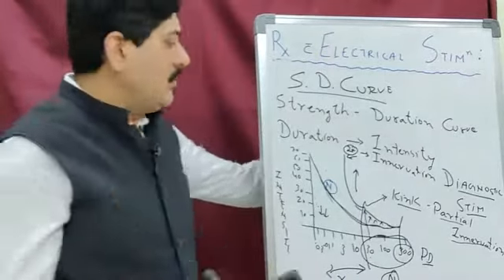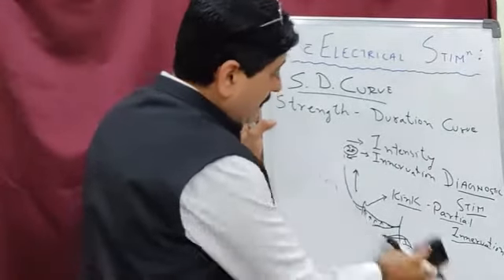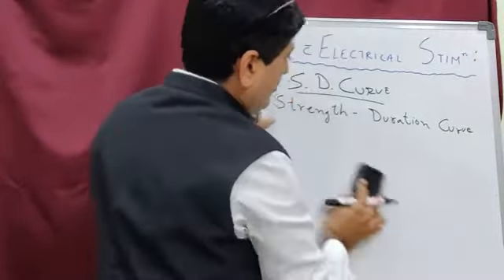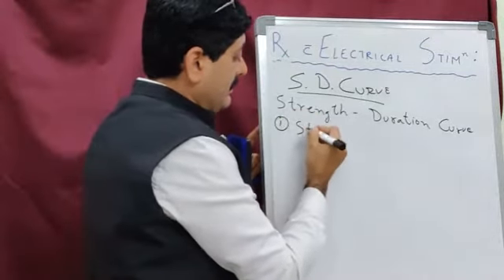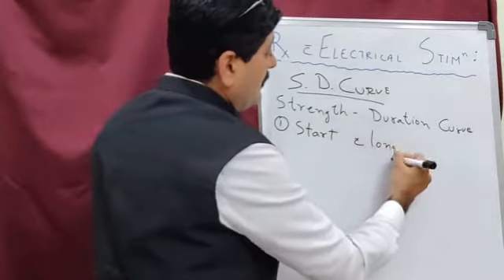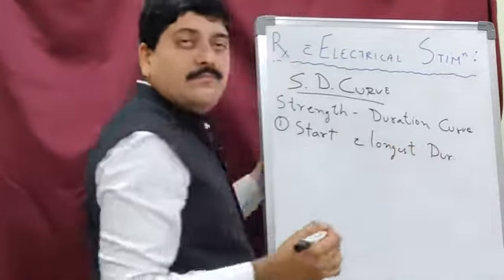Now certain things you have to remember when we talk about the strength duration curve, right? Number 1, start with the longest duration.